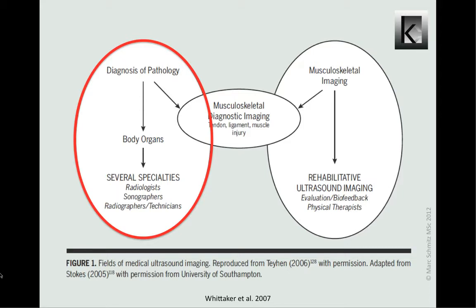Diagnostic MSU requires different skills and training than those needed for RUSI. More about diagnostic MSU within physiotherapy will be discussed in the second part of this video presentation. Why the skills and knowledge about diagnostic MSU are an absolute requirement for applying RUSI successfully will also be explained in the second and third part of this video presentation.